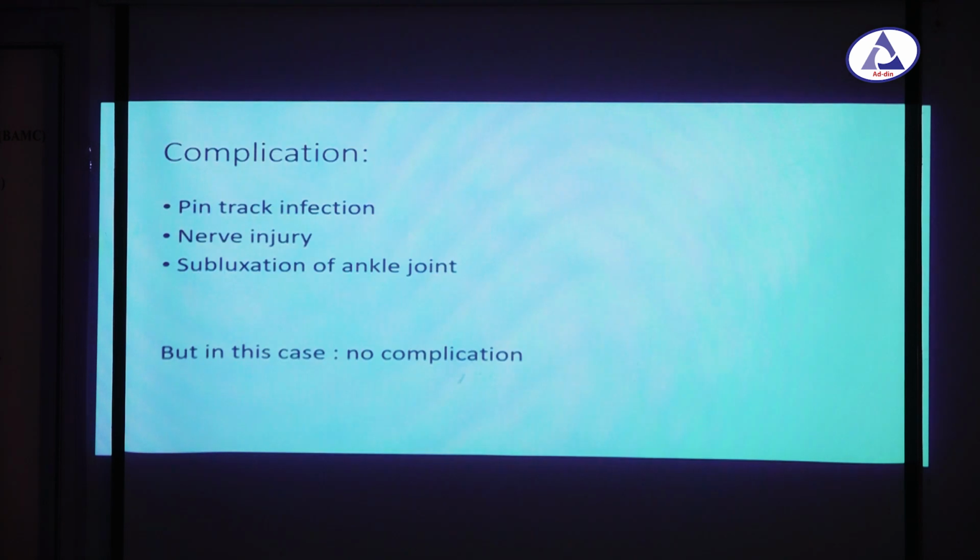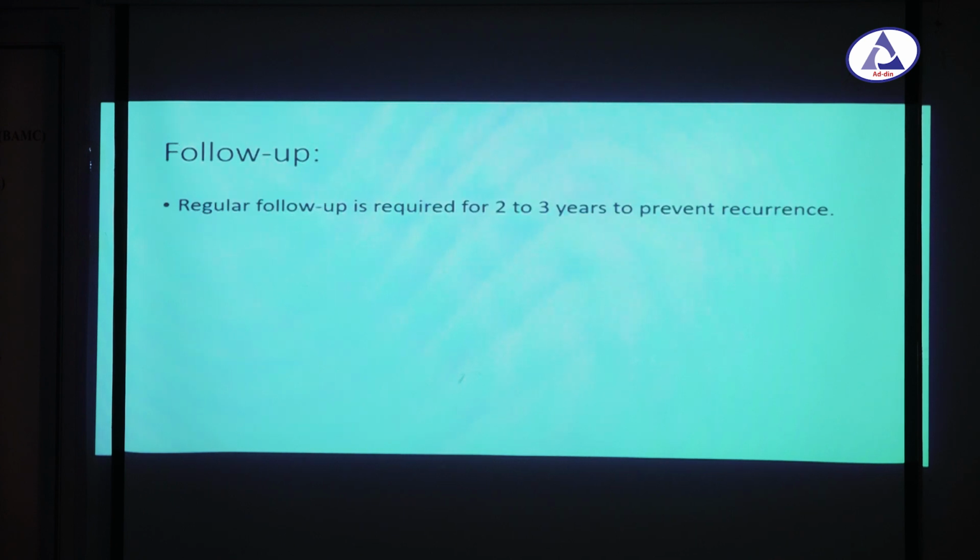And there is a very minimal chance of complication in case of Ilizarov surgery, like pin track infection, nerve injury, and subluxation of the ankle joint. In this case minimal pin track infection was present, which we can consider as no complication. There was no nerve injury and there was no subluxation of the ankle joint in our case. And the patient needs follow-up for up to 2 to 3 years to prevent recurrence.